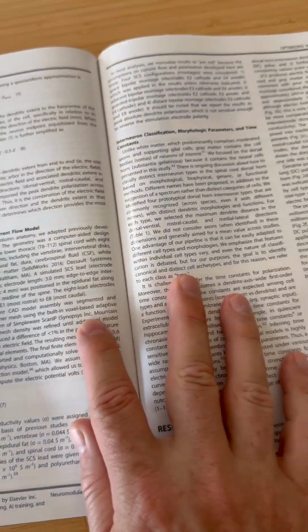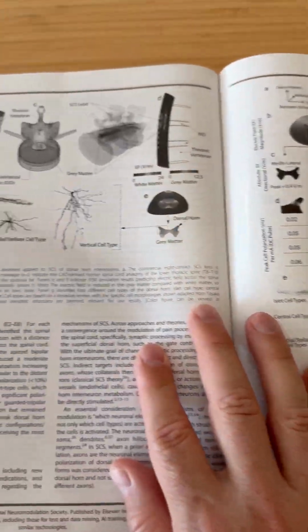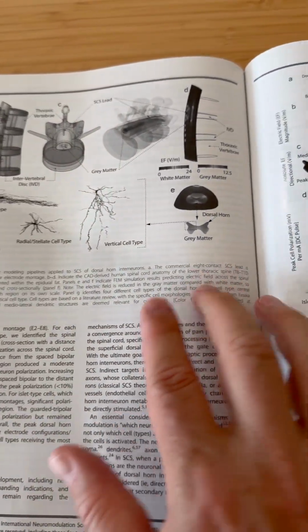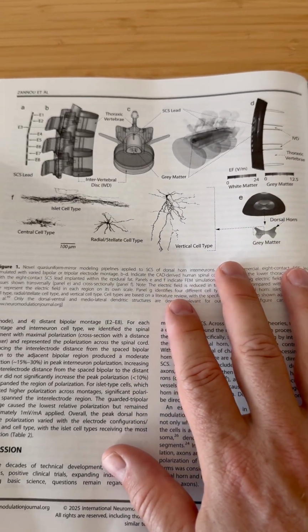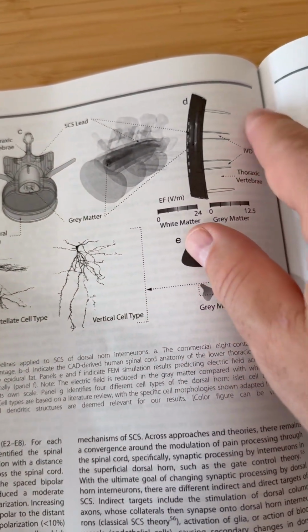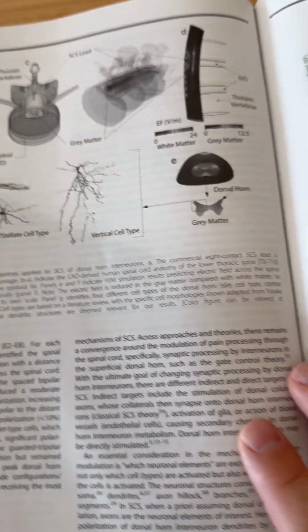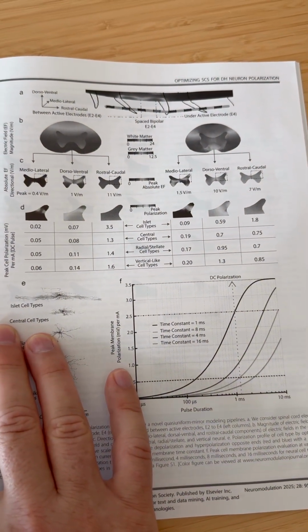What that basically means is that we made a lot of assumptions in order to simplify the process of the computational model, but understanding that is not relevant if you're just interested in the big picture. Here's that same figure again in grayscale, where we are simulating, with a CAD-derived model of the spinal cord, how much current gets into the spinal cord, and then the resulting polarization. And so these are the kind of results that we're seeing here.